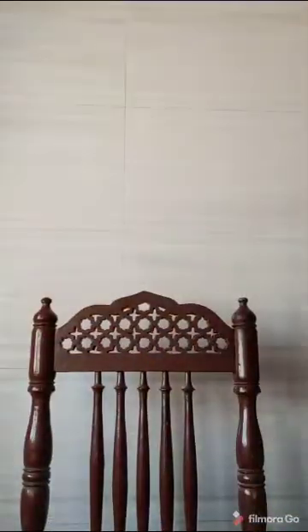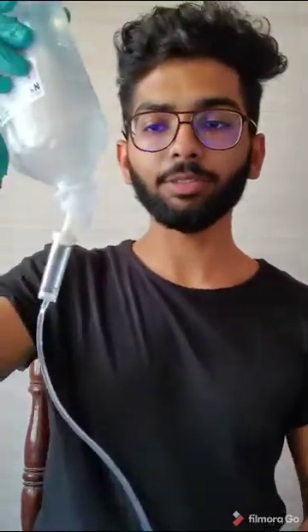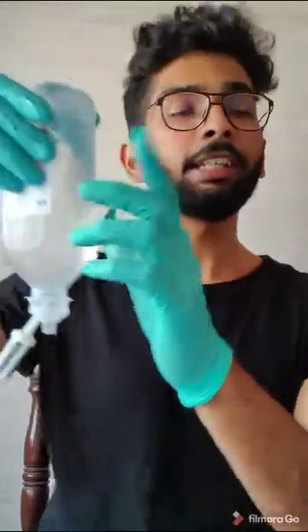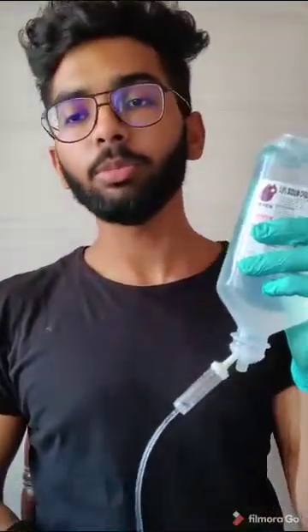Make sure the regulator is closed. Let me show you how to close the regulator. The regulator needs to be in the closed position. Then, as this will be hanging on the stand, we need to make sure the puncture on the skin is done. We will put it aside for now.